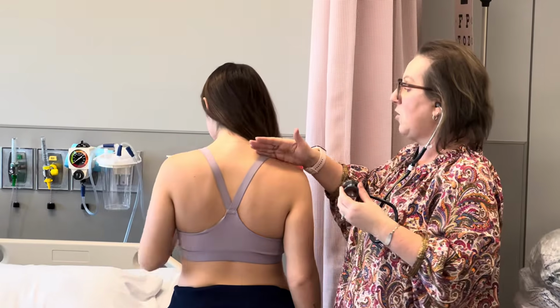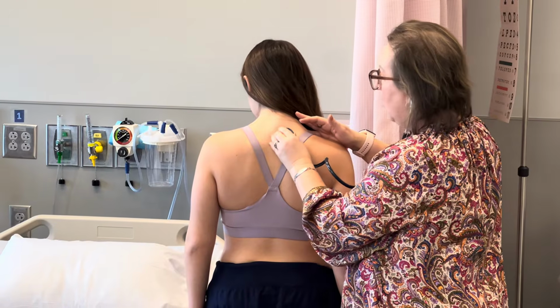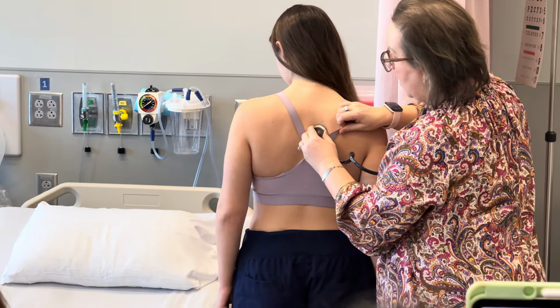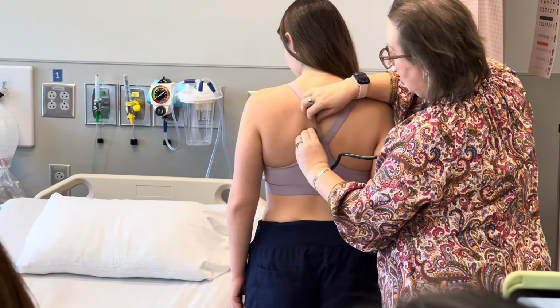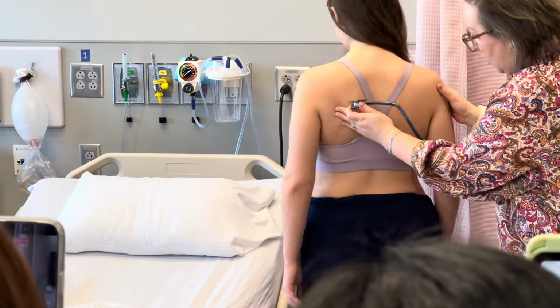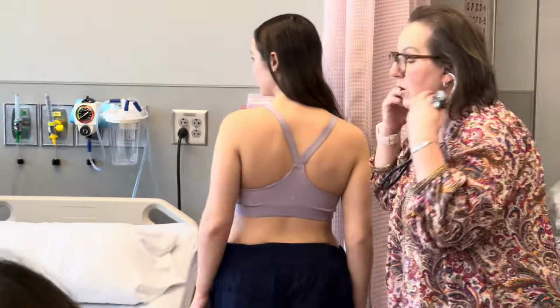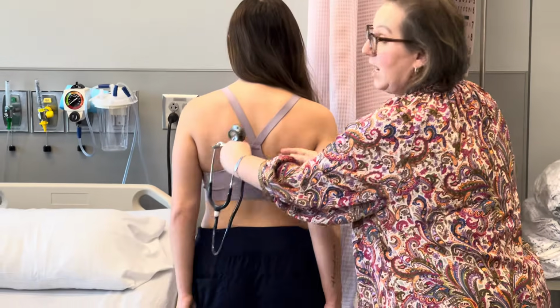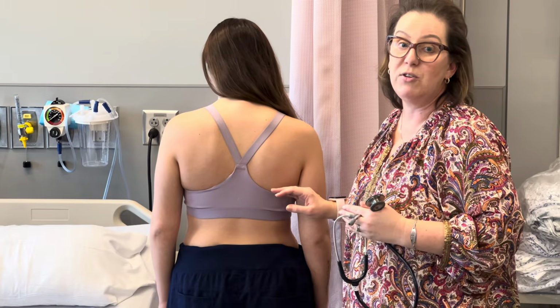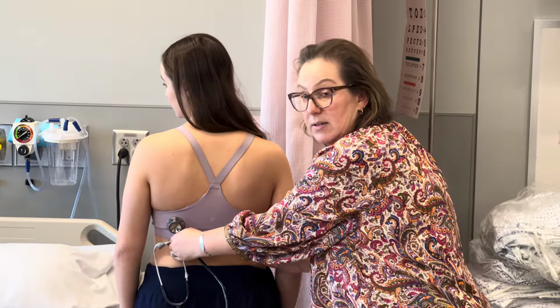With posterior, we start above the scapula. 1, 2, 3, 4, 5, 6, 7, 8, 9, 10, 11, 12, nope, stay that way, 13, 14. So as you go down, you're tracing the scapula. You're not listening over the scapula, you're going right around it. And then as you get to 10, 11, 12, 13, 14, you're listening more laterally so that you can listen to the sides of the lungs.